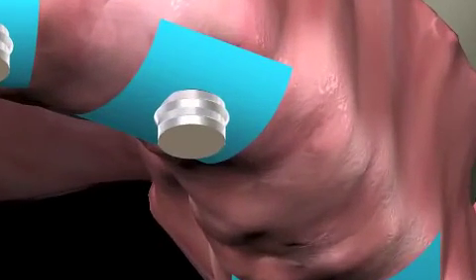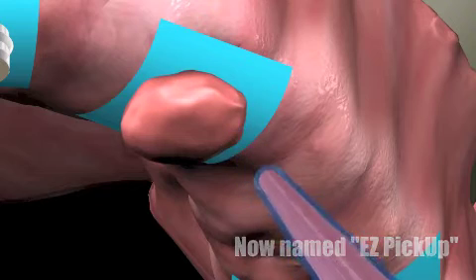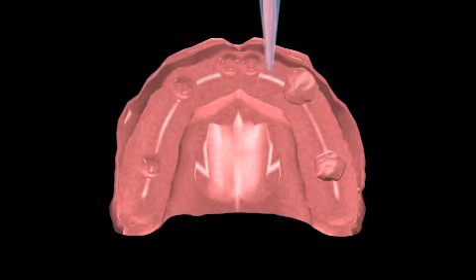Add composite ERA pickup over the top and sides of the metal jackets. Place additional resin in the recesses of the overdenture.